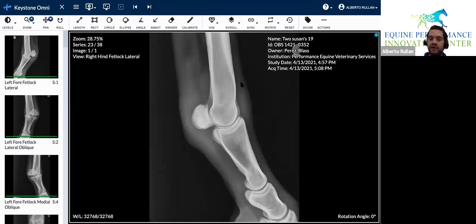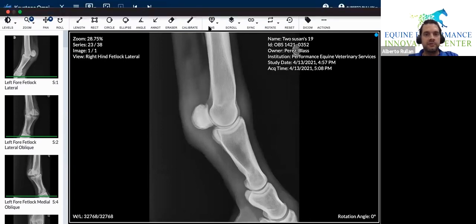And right here, we're going to go to, again, now the other side of the horse. I don't think we need to go to the other side of the horse, right? You got that? We can go to the larynx. Let's go see some scopes. Doctor, good? Ready to see some scopes? All right, so now let's go and see some scopes.